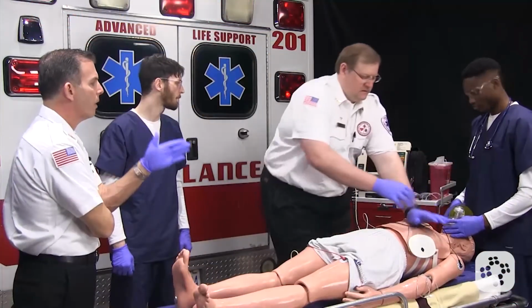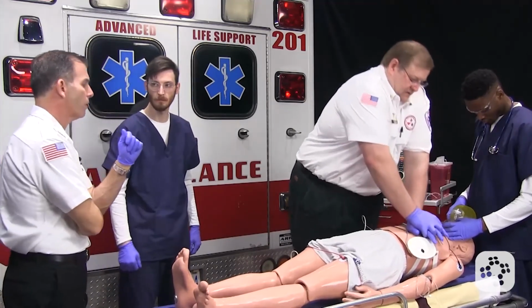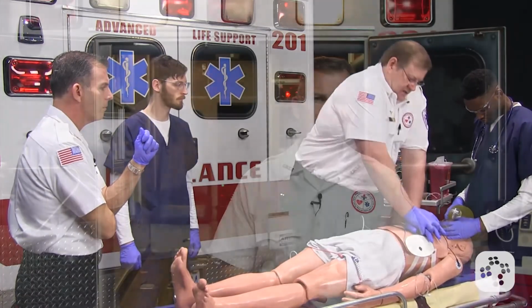Now, after 2 minutes of CPR, it's important that the compressor switches with the defibrillator. This helps to make sure that we have a fresh compressor who will be able to give us consistent compressions at a rate between 100 to 120 compressions per minute at the appropriate depth.